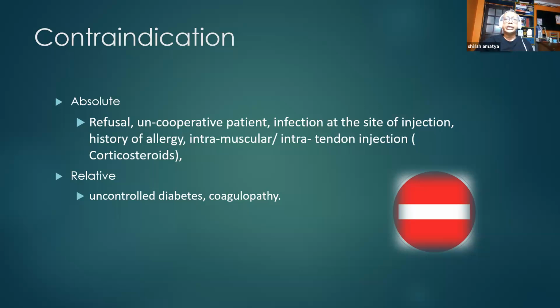And in this study, he showed that even after 4 weeks of the procedure, there were no significant hemorrhages. So this shows us that coagulopathy is not an absolute contraindication. It is a relative contraindication. If you are expert enough, then you can go for it. Or if you are a novice, you can stop the drugs and then go for the injection.